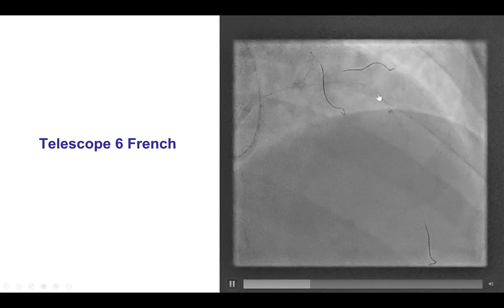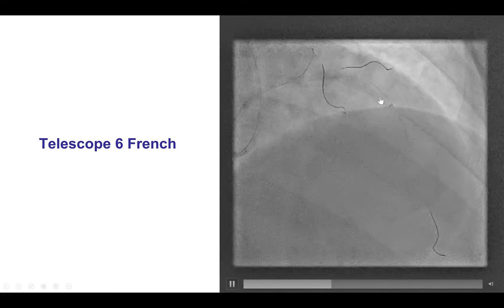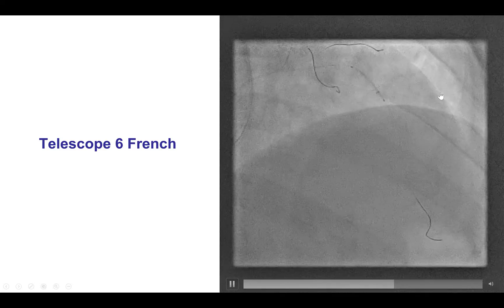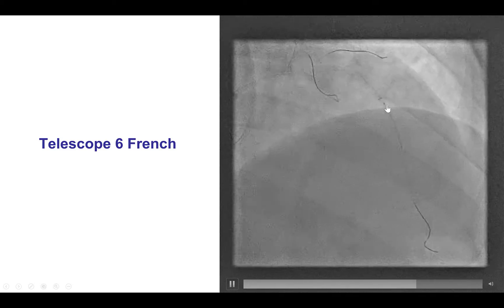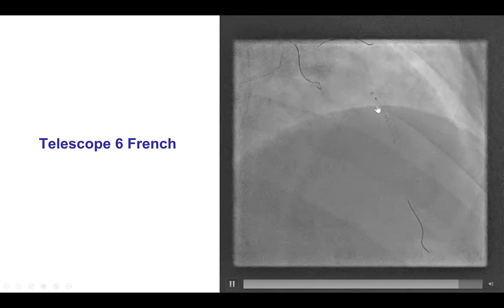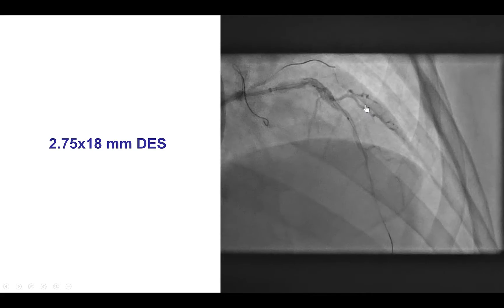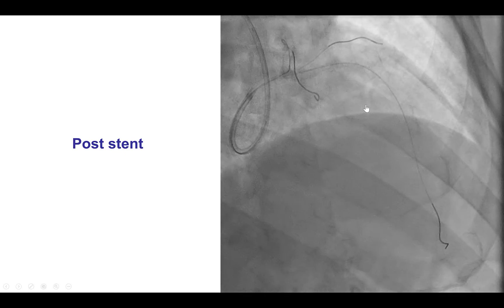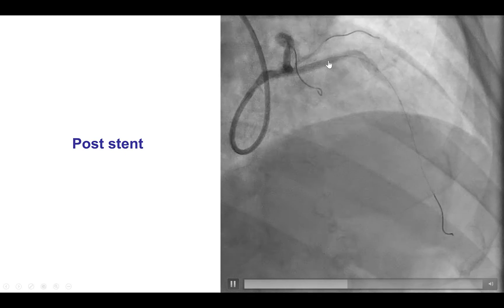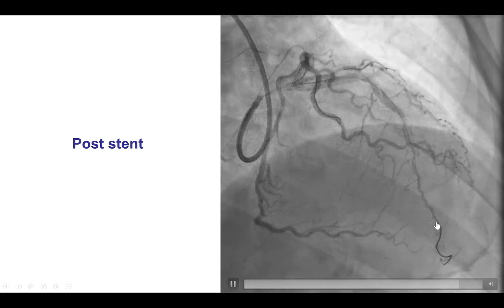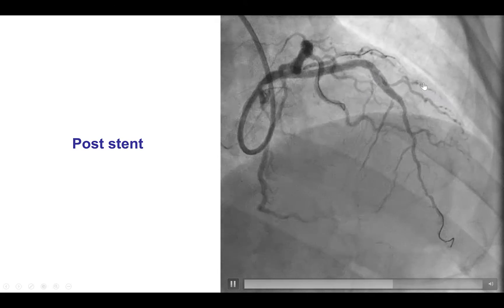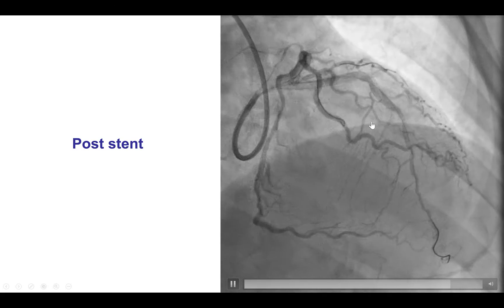To deliver more stents further down, we used a guide extension — a 6Fr Telescope — which made delivery of another stent to the middle LAD very easy. This was subsequently deployed, providing a nice result with TIMI 3 flow into the LAD without losing any significant diagonal branch.